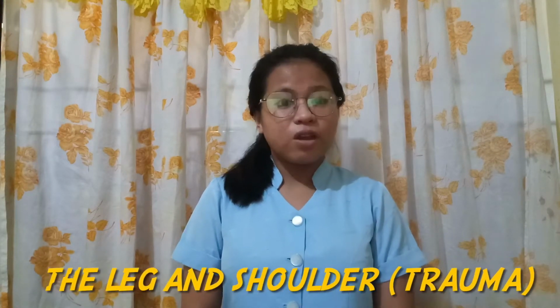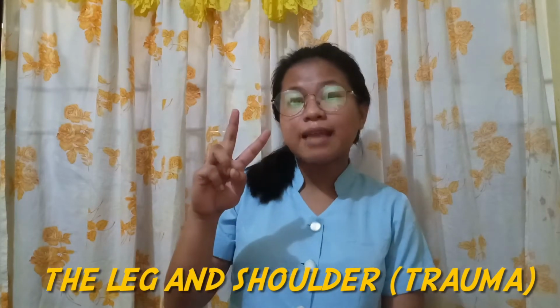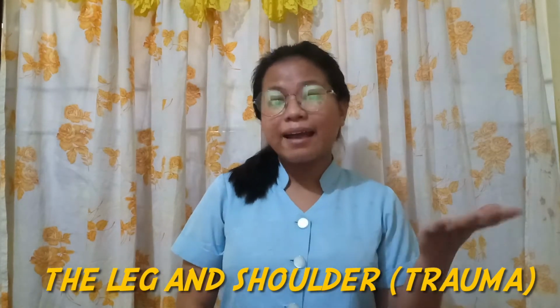So for today's video, I am going to show you the two different types of the position of the leg and the shoulder trauma. For the leg, I'm going to use the AP projection, while for the shoulder trauma, I am going to use the tangential projection, supraspinatus outlet shoulder trauma, also known as the Neer method. And if you want to know more, just keep on watching.